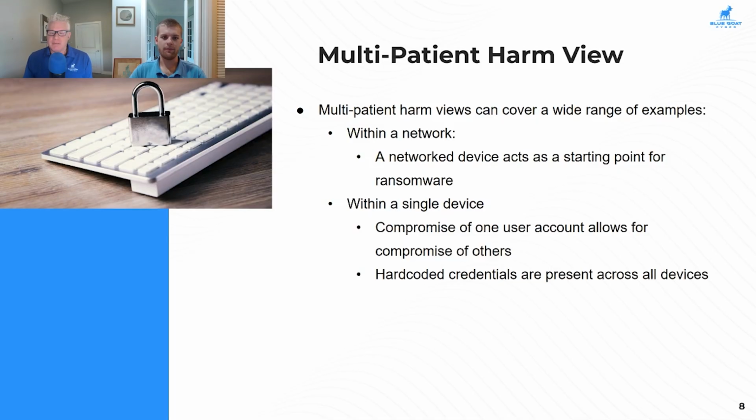One of the first medical devices I worked on, I think this was in 2014, had this exact problem, where the field technicians had a hard-coded password in order to get into the device. And one of them posted it on the internet so he would have easy access to it, but it was openly accessible, and we were able to find that. So basically, somebody could get into every single device from that manufacturer using that password in maintenance mode.